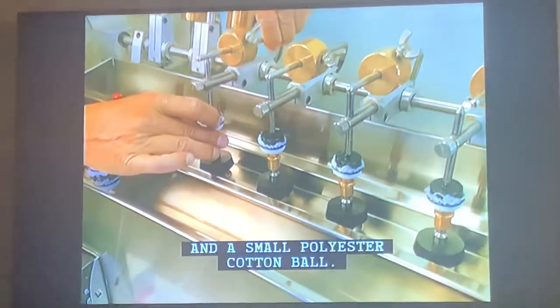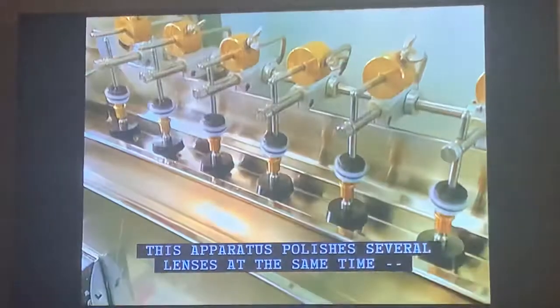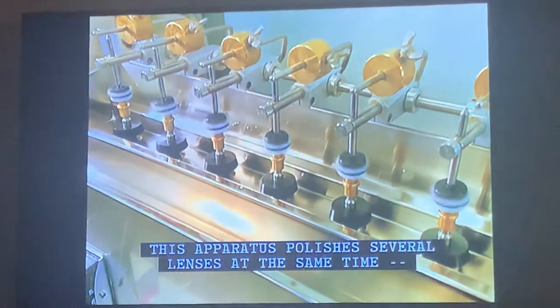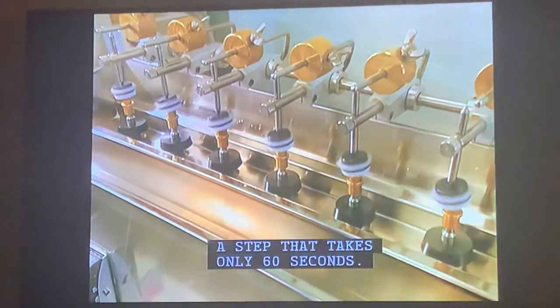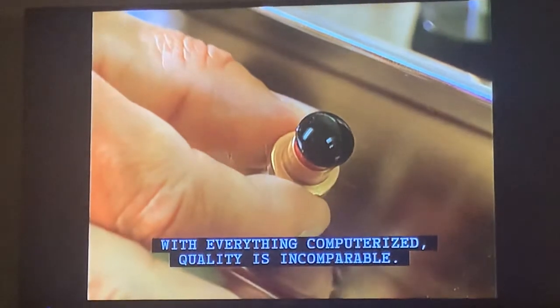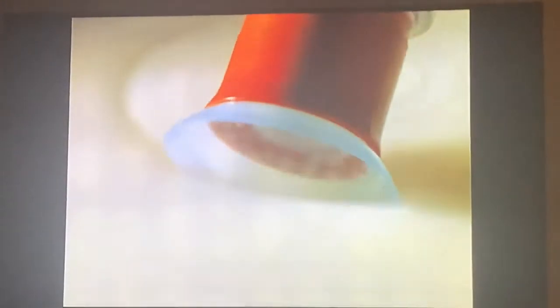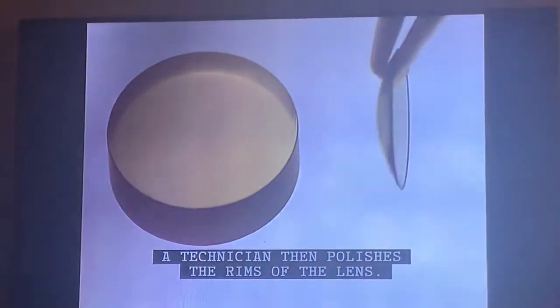Some oil and a small polyester cotton ball are used in polishing. This apparatus polishes several lenses at the same time, a step that takes only 60 seconds. With everything computerized, quality is incomparable. A technician then polishes the rims of the lens.